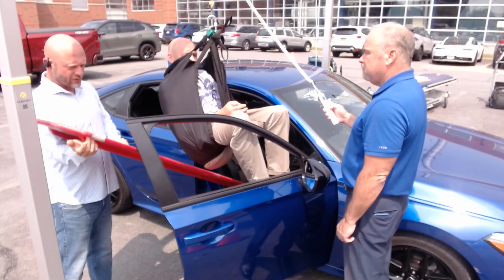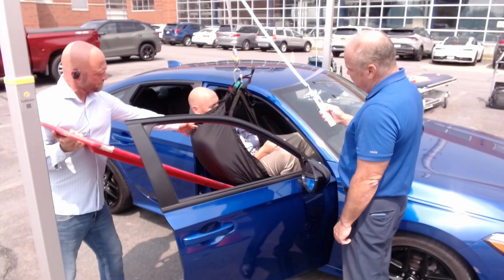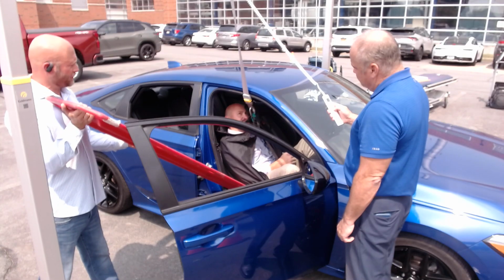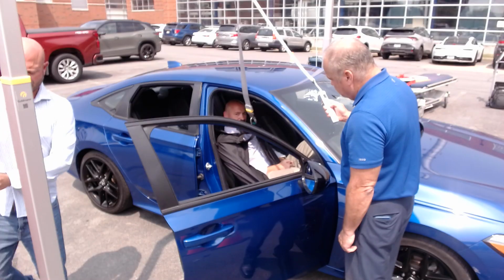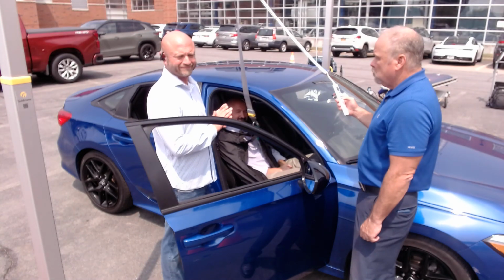And as the patient goes down, slides in. Patient's into the vehicle. Move the slide board, unhook your patient, and they're free to go home and not be able to get out of the car by themselves again.